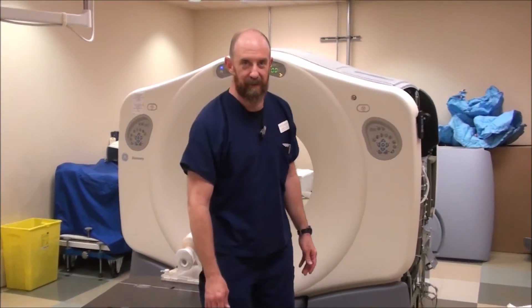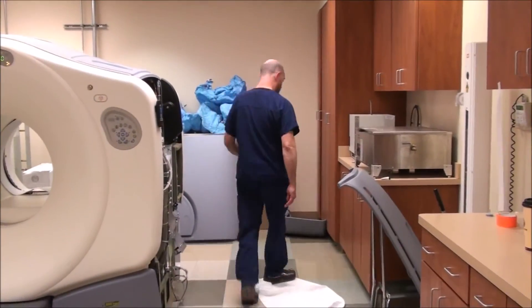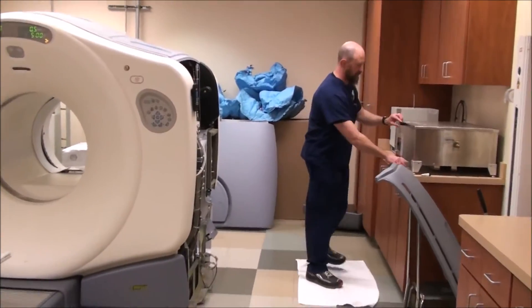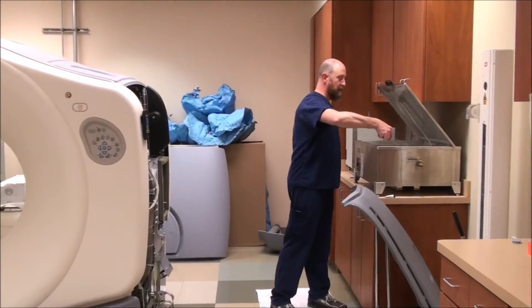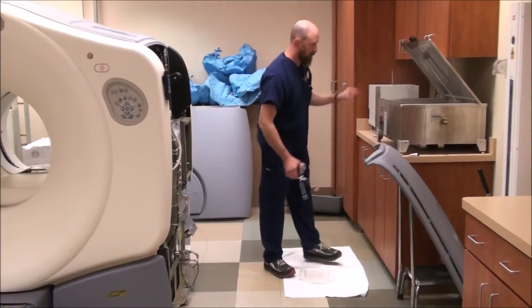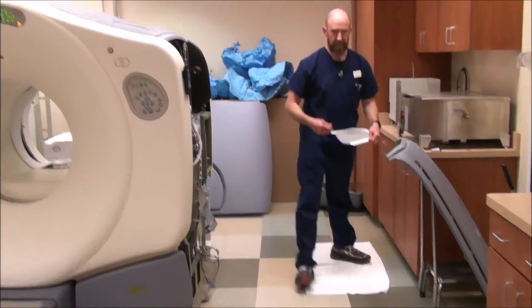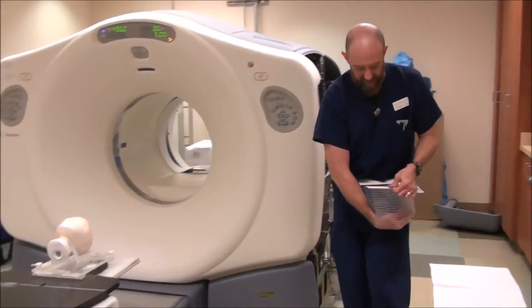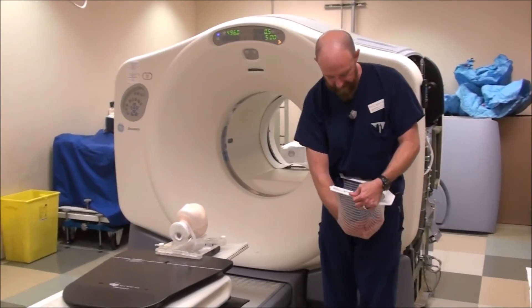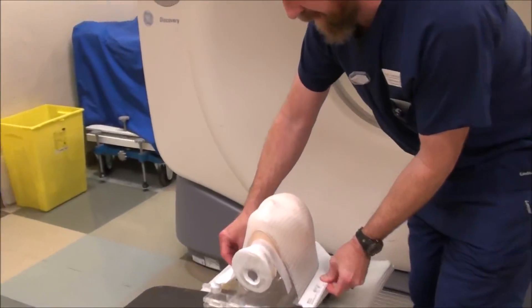So, just like on a cooking show, I've got one in the oven already. We're going to go right through this. You're going to pull the mask out of the water, throw it on the ground. Now give it a whack, turn it around so it's open like this, give it a stretch — see, it's already setting up. Give it a stretch, get it on the patient, and then push it right down into place.